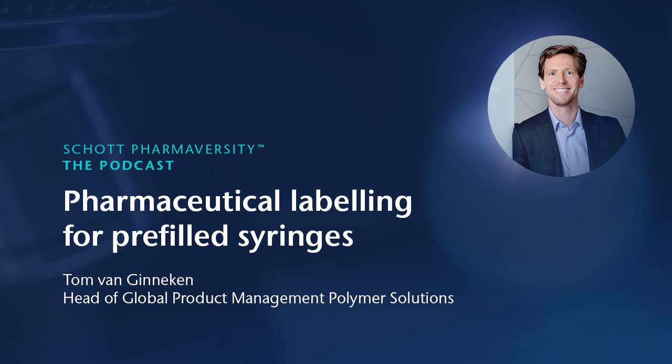Yes, so you're absolutely right. Let's say the first association people have with labels is definitely for information purposes. So it's an information provider. If we look at typical prefilled syringes, most of them do have labels, and the label provides information for drug name, dose, safety information, batch information. But actually, the label can do much more than just providing this information.